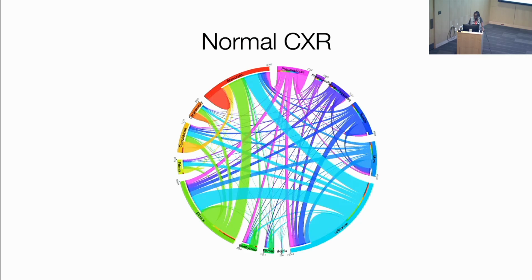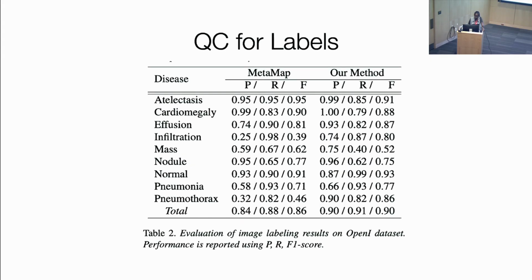And then they sort of had a quality process, right? Because you have to go back and say, again, what's the radiologist? That part is still a gap, I would say. And so they compared it with the OpenI dataset from Indiana, which has human annotators.